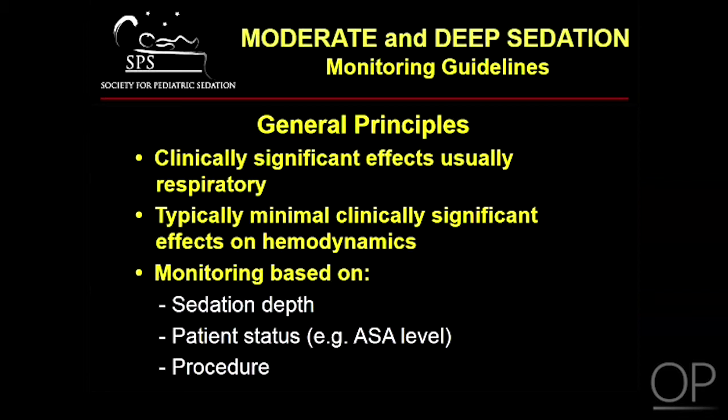Monitoring recommendations are based on the depth of sedation, the nature of the procedure, and the patient's clinical status. One way to categorize a patient's clinical status is by using the American Society of Anesthesiology illness classification levels. The first principle considered in these recommendations is the respiratory nature of most adverse sedation events. Hemodynamic disturbances are typically minimal. Therefore, monitoring requirements primarily focus on the assessment of oxygenation and ventilation.